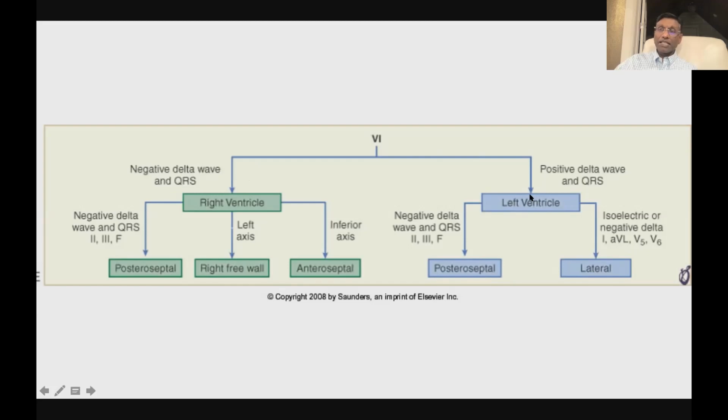That is, at least the concept of bundle branch block, which is if you have a left bundle branch block, your left ventricle is being activated like, no, perhaps that might not be a good example. Let's think of PVCs. If you had a PVC originating in the left ventricle, then you would have a positive on the left side. And so V1 would be positive for a left-sided pathway and negative on the right-sided pathways.